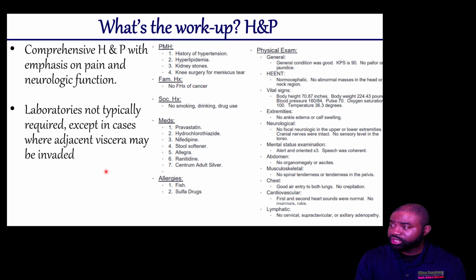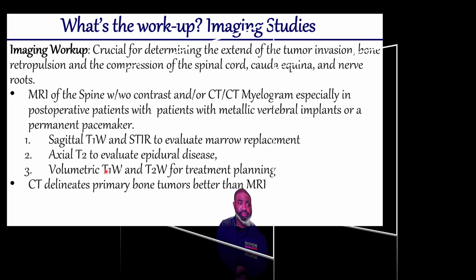Now you could see some of the questions that the oncologists typically answer, but the focus here is on pain, and typically the pain score is an indication of the grade, as well as it is used to classify whether the patient is appropriate to receive stereotactic radiosurgery or not.